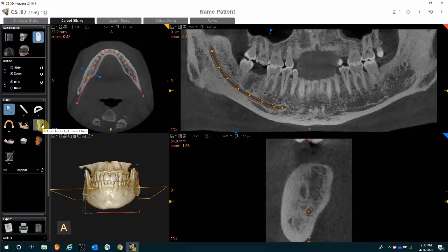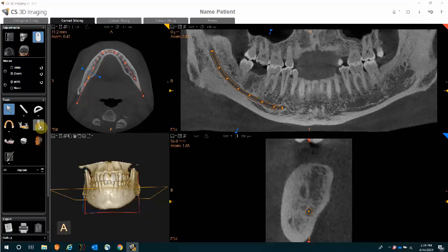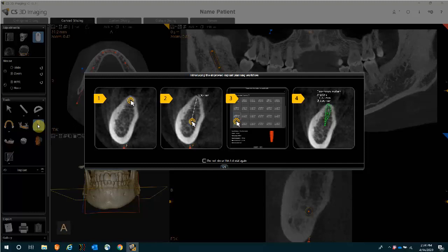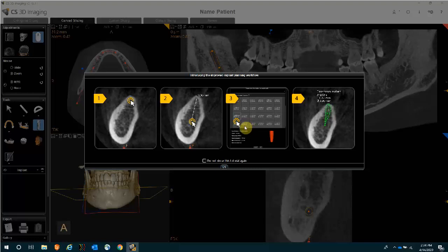With the panoramic view displayed, the nerve traced, and the potential implant site displayed, click the icon in the left-hand tool section that looks like an implant to activate the implant placement tool. As you click on that icon, you are given instructions on how to place an implant. In step one, click at the top of the bone. In step two, drag down and angle left or right, and when satisfied, click again. If you don't want to see this tutorial again, select the option not to show it again and click OK.